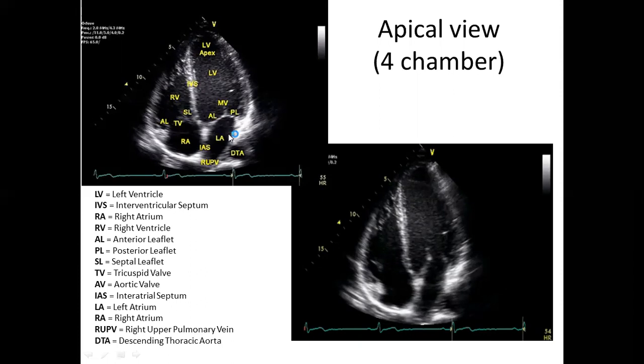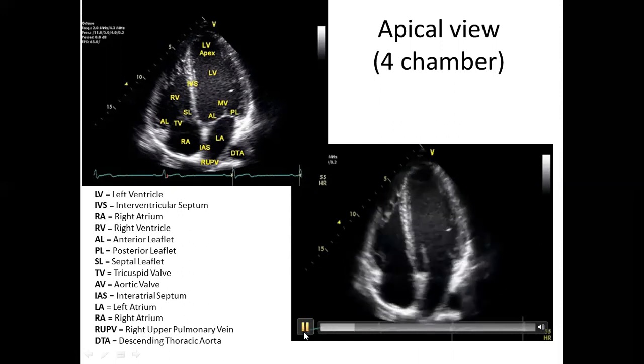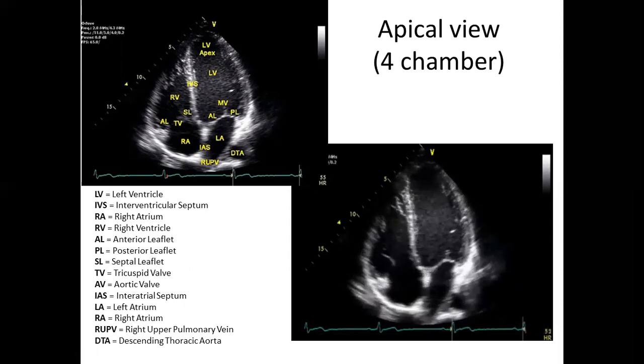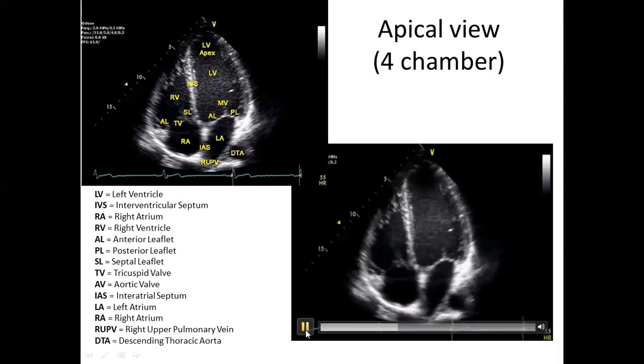Here is valves. Please, let me not put too much speaking into this explanation. Again, stop the video and try to read all the abbreviations right there. And here is how it will look like on the actual imaging. So let me play it once more.